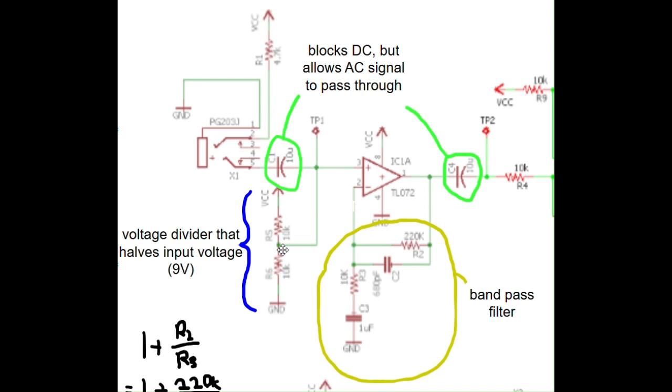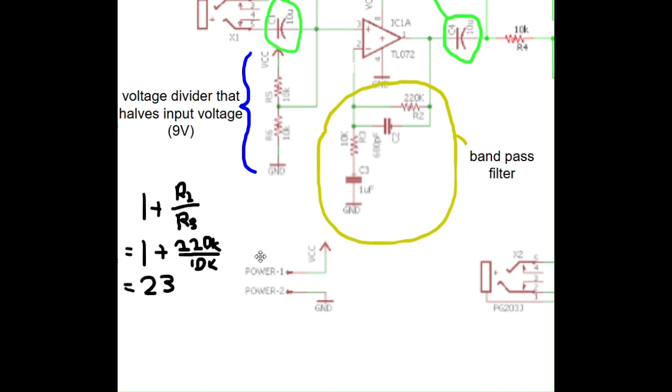It acts as a level shifter that prevents the sine wave from being distorted and is forced to single supply mode. The output is looped back into the inverting pin of the op-amp through capacitors C2 and C3 and resistors R2 and R3. Together, the capacitors and resistors form a low-pass and high-pass filter connected in series, which results in a band-pass filter. By doing some calculations, I can conclude that the band-pass gain is 23 using the following formula.